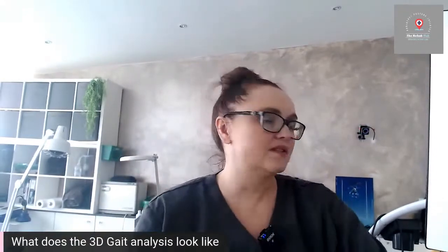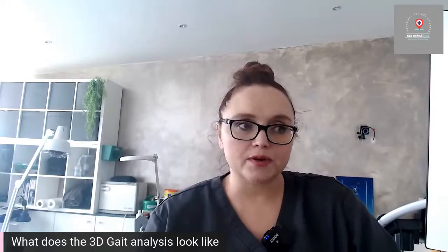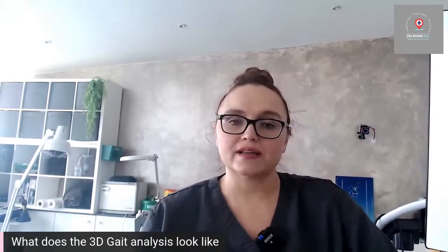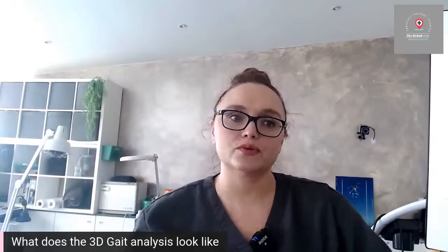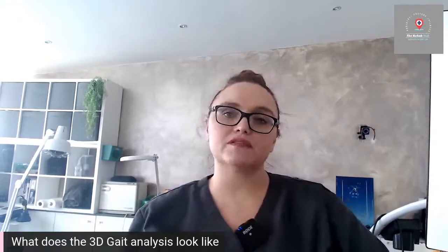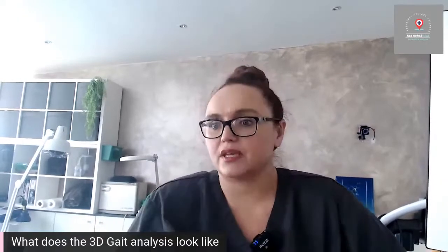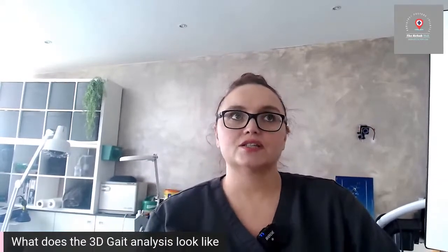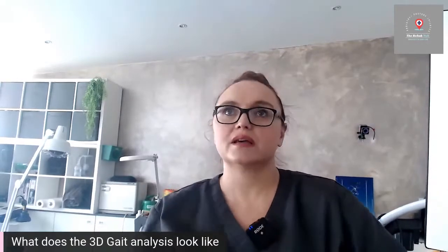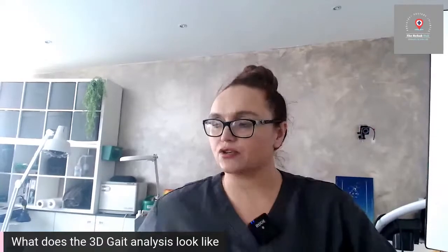So it's at that research standard. As I said, this was developed by Run3D, a spin-out company out of Oxford University. It is at the standard that it is gold standard at that research hospital, university hospital type level. So it's the first time this has really been available to the general public. You haven't really had this sort of in-depth, thorough analysis available to you. It is pretty new.